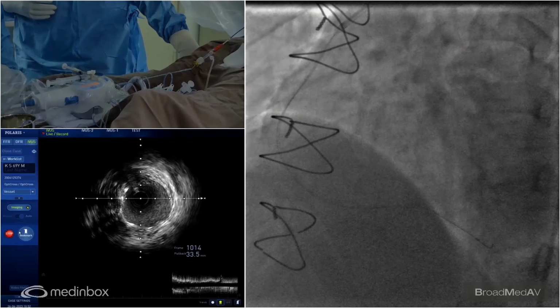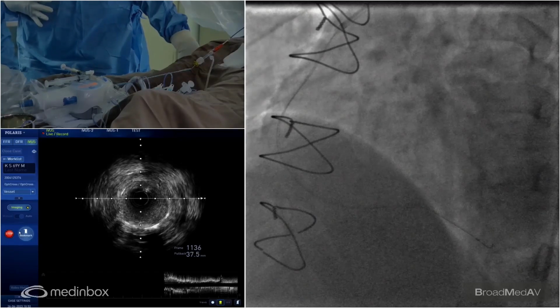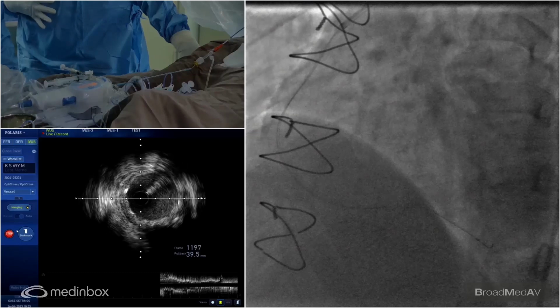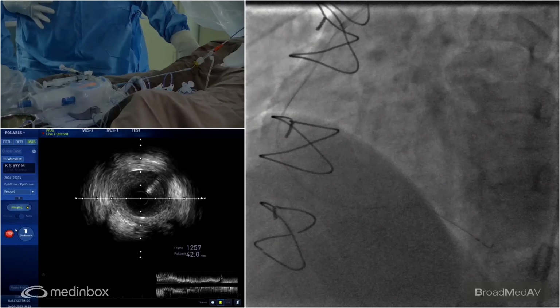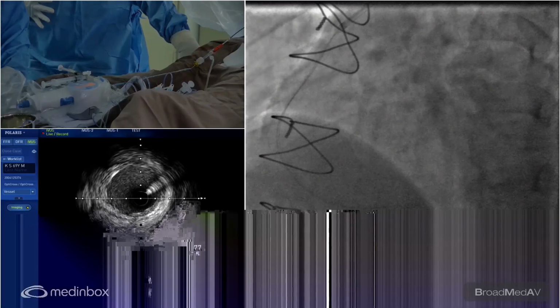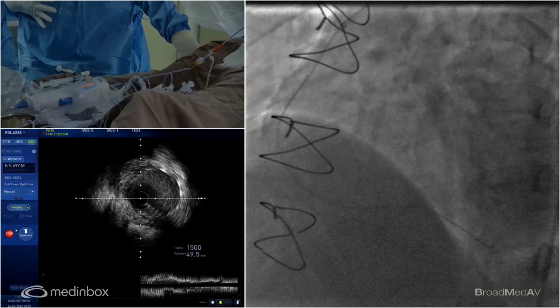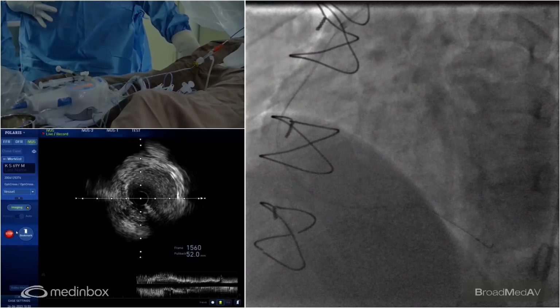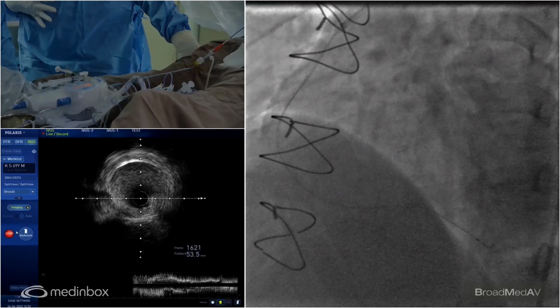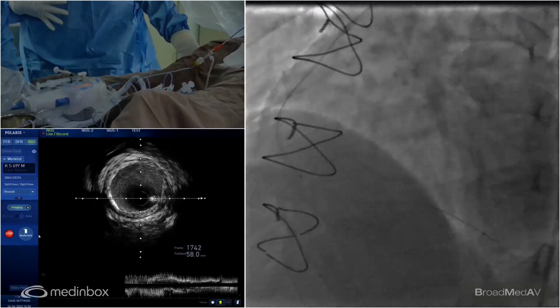And this is the vein graft, which is reasonably well expanded. And if you can notice, the overall expansion appears to be good. Coming to the proximal portion where we had a size of about 3.5, whether these stents can stretch up to that, I think it has expanded. It has expanded over here. I don't see any under expansion at this portion.